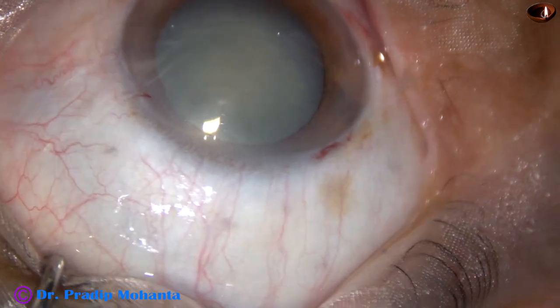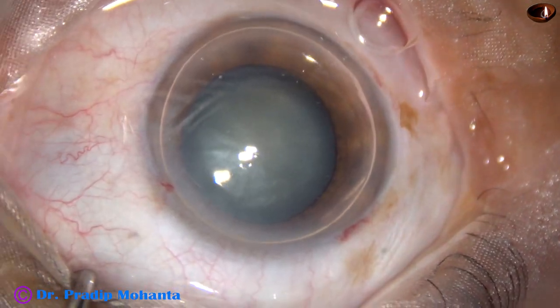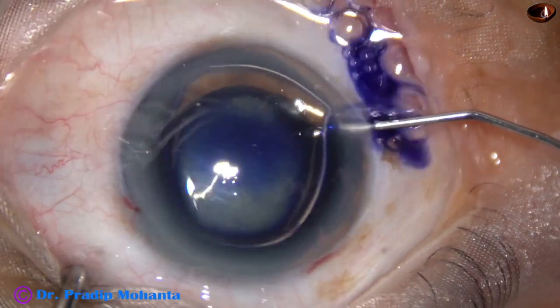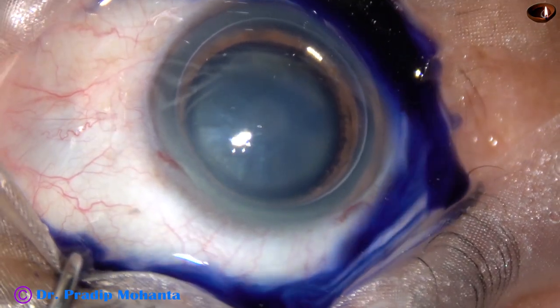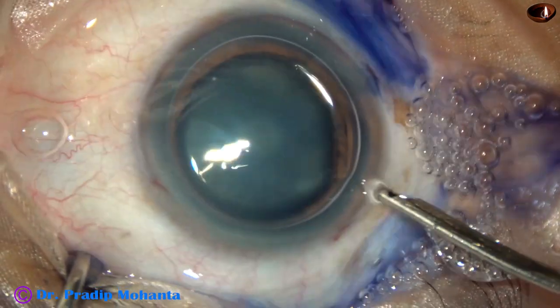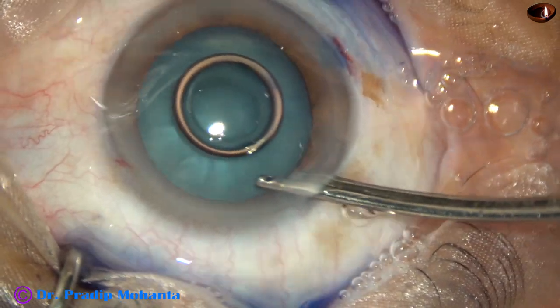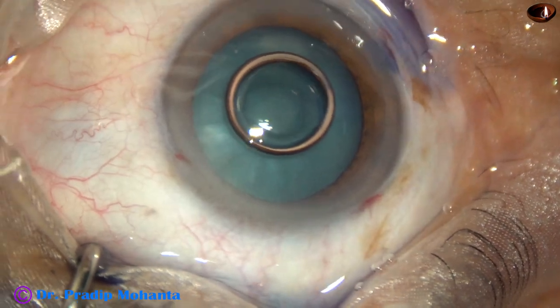Now this is an air bubble. Beneath this air bubble, trypan blue 0.06 percent dye is applied over the anterior capsule. Staining becomes very good in a very short time. If we stain the anterior capsule underneath an air bubble, the dye is then washed out with BSS balanced salt solution.